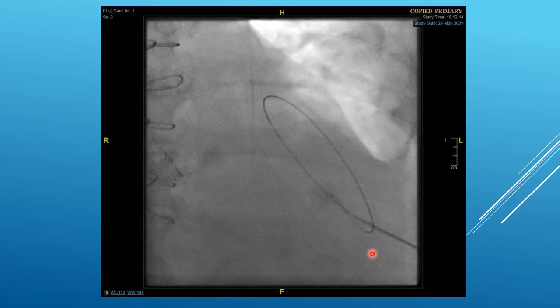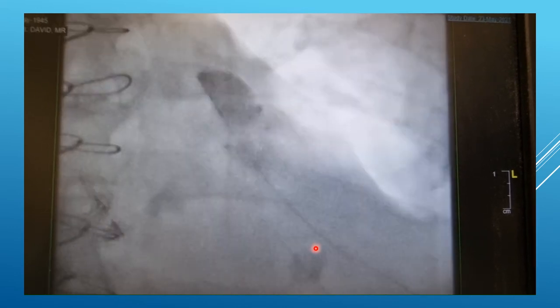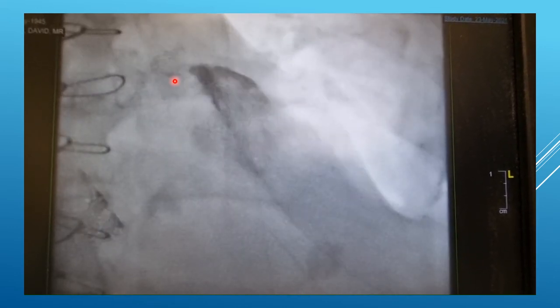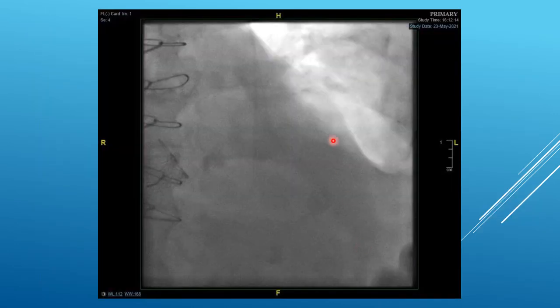Sometimes the wire, no matter how you manipulate it, doesn't want to wrap around the heart. Here's an example where we were pretty sure the position was pericardial, but maybe there were some adhesions — we couldn't feel adequately certain. So injecting some X-ray contrast through a four-French dilator, we can see that this contrast is pericardial. Waiting a moment and screening again, you can see the contrast remains in the area where we were only able to deploy the wire — this would have been a loculated pericardial effusion. The fact that the contrast is staying put tells us that it's pericardial.